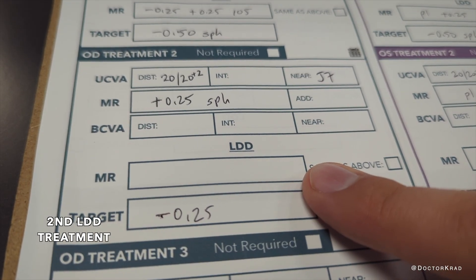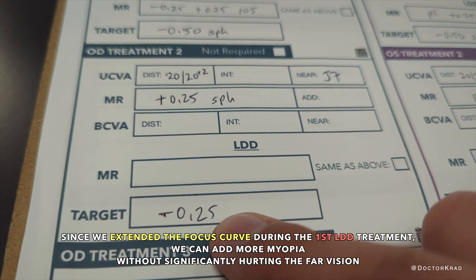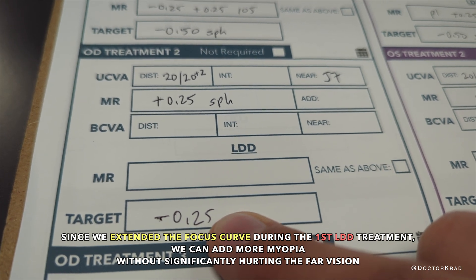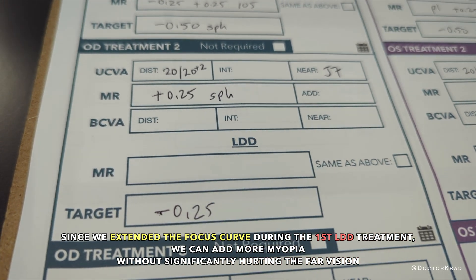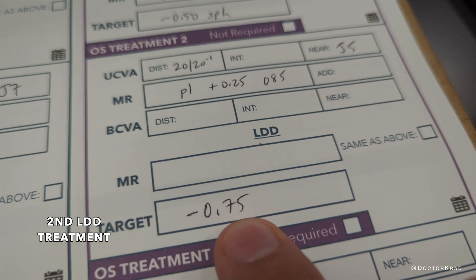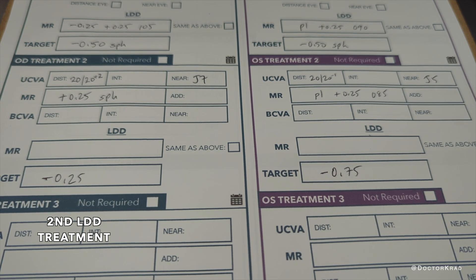Here we are on treatment two. His refraction was plus a quarter, and I have the option of targeting either plano or maybe minus a quarter. Since this is his dominant eye, I do not want his distance vision to suffer. But it looked like when I put a plus half diopter trial lens in front of his right eye, he really appreciated the near vision improvement and didn't seem to mind the change in distance vision. So I'm okay with shifting a half a point on this right eye. For the left eye, his non-dominant eye, I am going to target a minus 0.75 — a little bit stronger on the reading — so that together, hopefully, he can see far and up close very well.